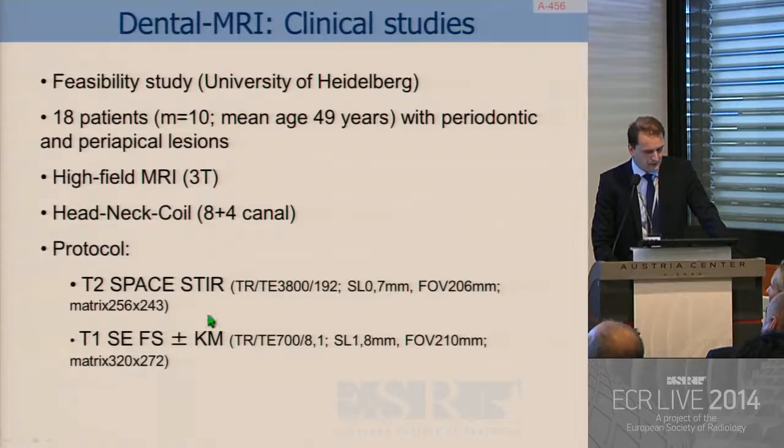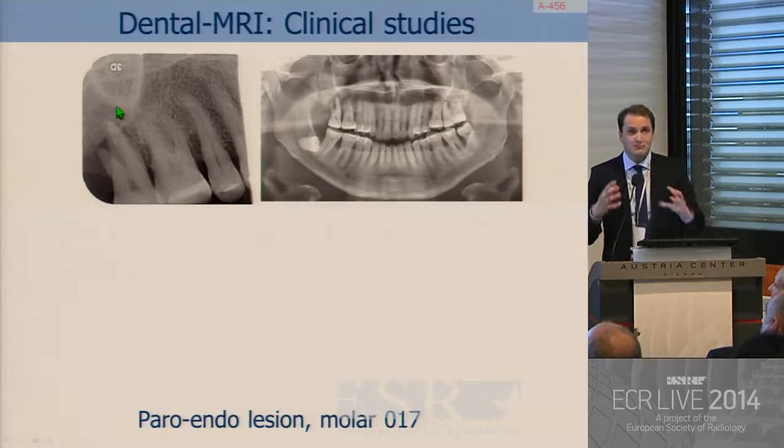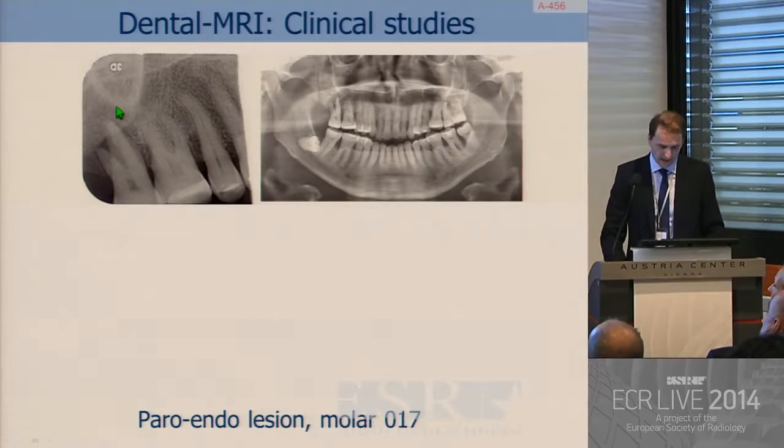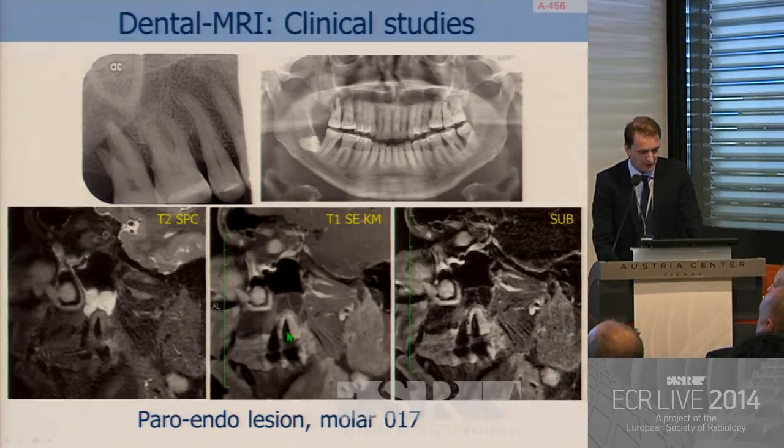And we performed these sequences with high-resolution T2 and T1 sequences before and after contrast administration. And I must say this was a little bit disappointing. As we tried to see big structures, big lesions, and we could identify them, but imaging was much less detailed, much less precise as before.